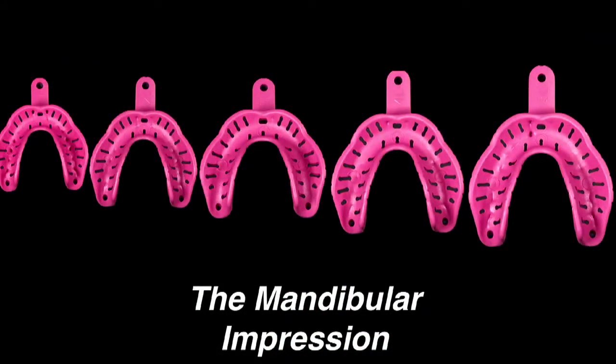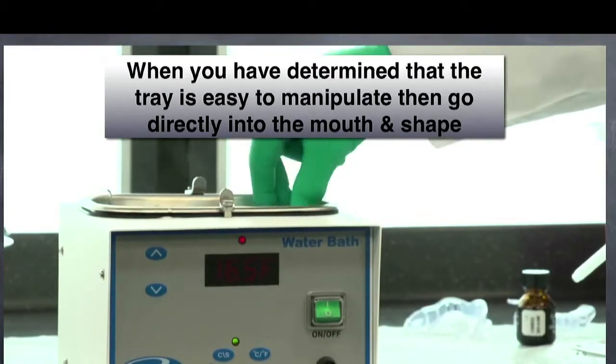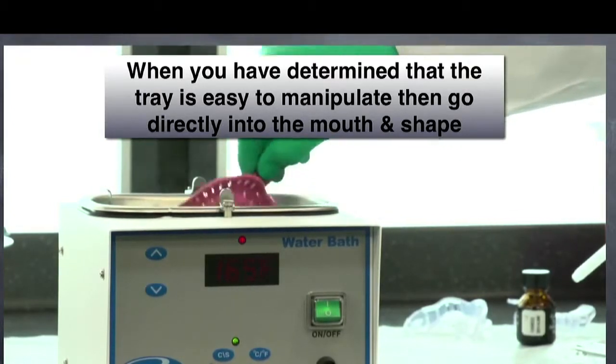Mandibular Impression. The Mossad Edentulus LT Impression Trays come in five sizes. Select the optimal size tray, then place into a heated water bath and soften.